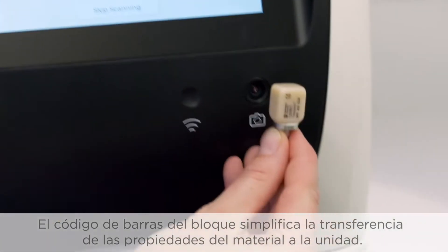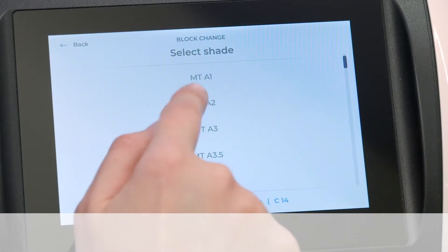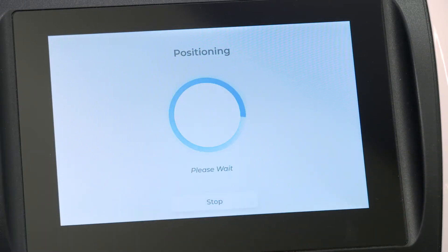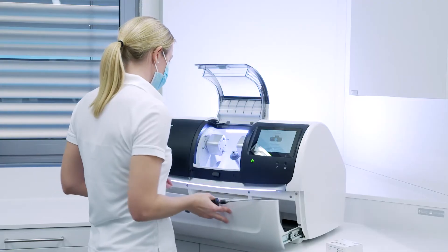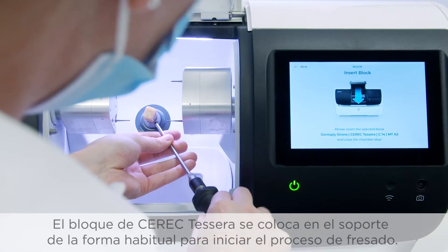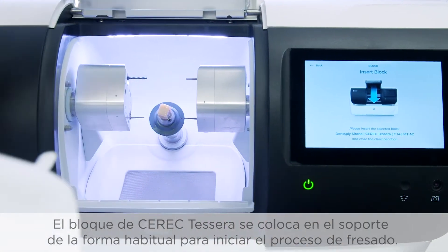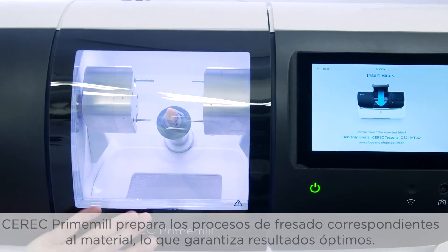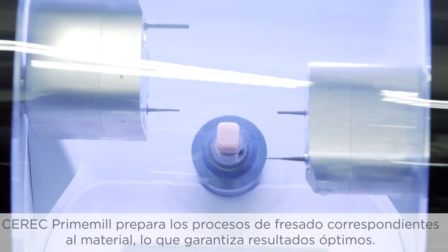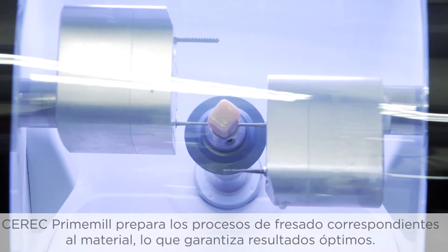A barcode on the block simplifies the transfer of material properties to the machine. The Seric Tessera block is then placed in the block holder in the usual manner to start the milling process. Grinding processes matched to the material are prepared in the Seric Prime Mill and ensure optimum results.